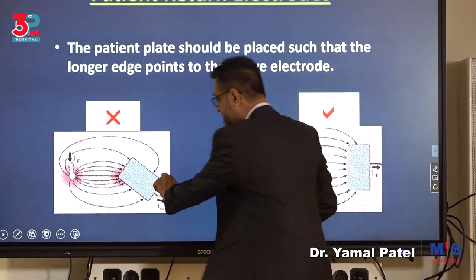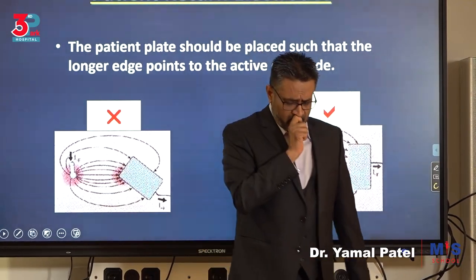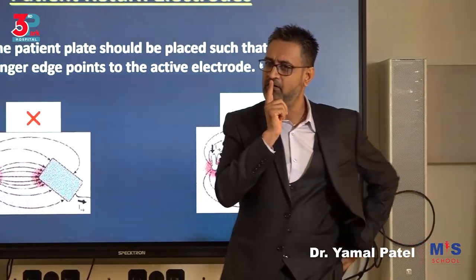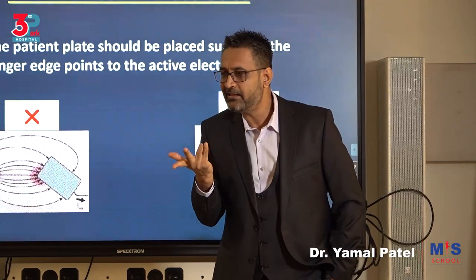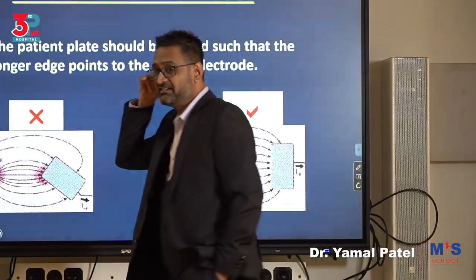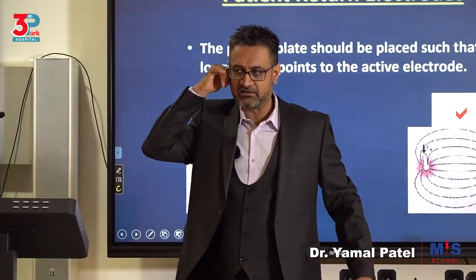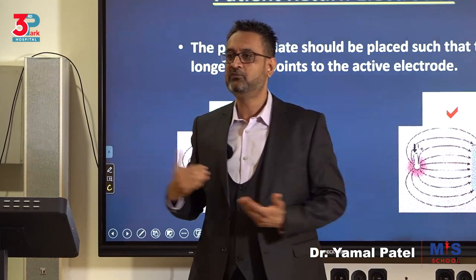And then you finish the surgery and peel this off at the end of surgery, you'll see a burn here. And you start wondering, what happened? I did not do anything wrong. You know what you're going to do? Call the manufacturer. Your machine is defective. Can you come? It's burned my patient. Can you come and check it out?